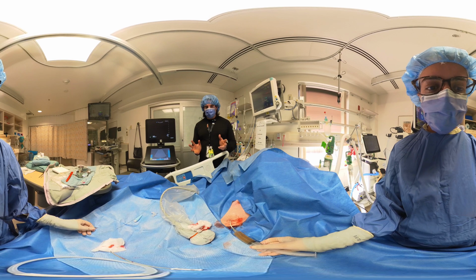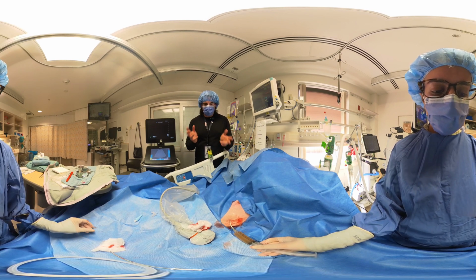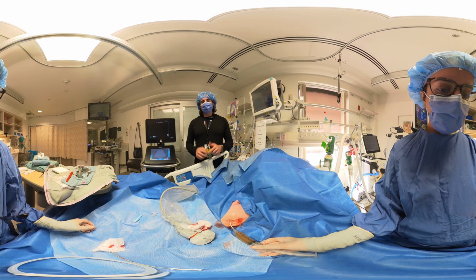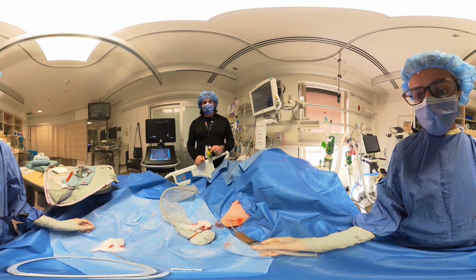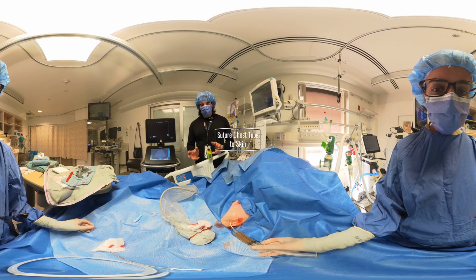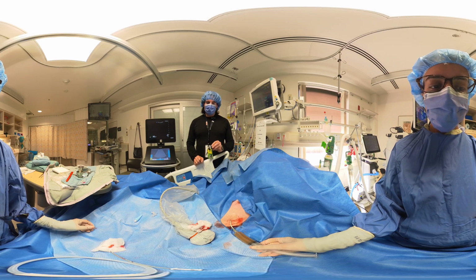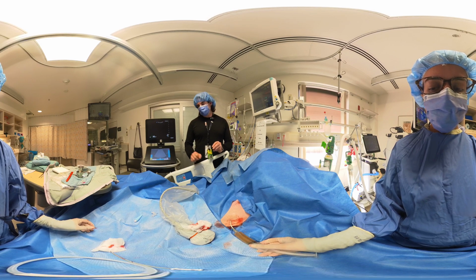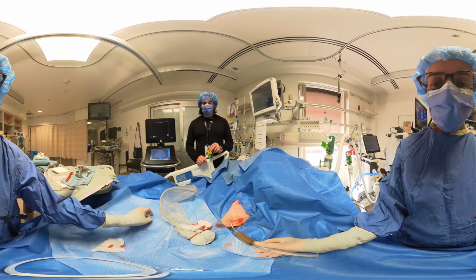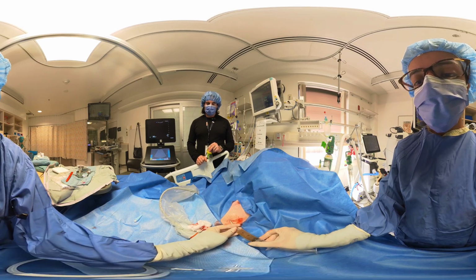So from here, this either could be thoracentesis, so you could take the tube out after you get a sample or drain it, or you can leave it in. In this case, we're going to leave it in as an indwelling chest tube. So we're going to suture it in with the suture first to the skin, and then once it's sutured to the skin, then we're going to attach the tube to a Pleur-evac. So now that we have a sample, what we're going to do is use the stopcock. We're going to swap it out for the three-way stopcock. And let's just undo the syringe there, put the stopcock on.